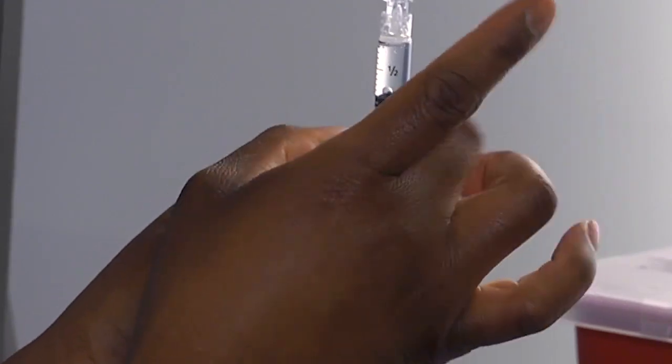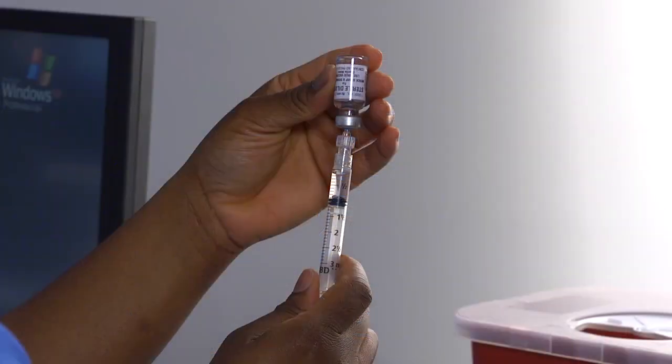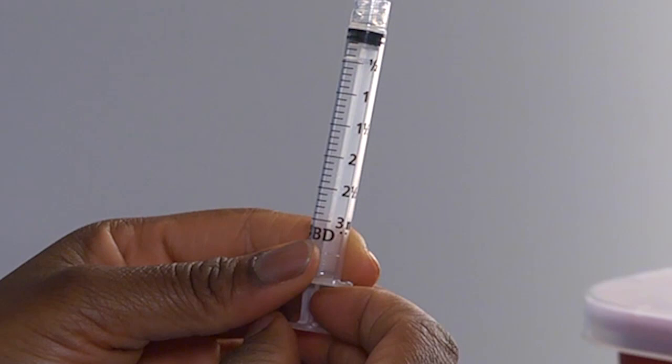Tap the barrel of the syringe to dislodge any air bubbles. If air remains at the top of the syringe, eject it into the vial. Recheck the volume in the syringe. Finally, remove the needle or needleless device. Hold the syringe vertically, needle up at eye level.